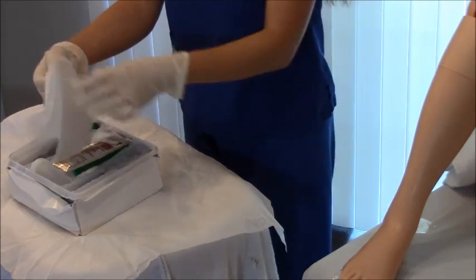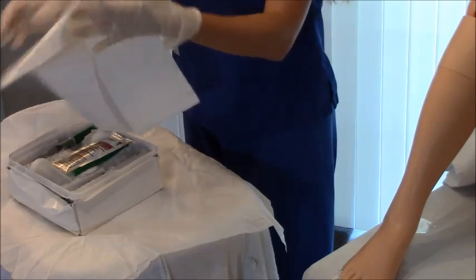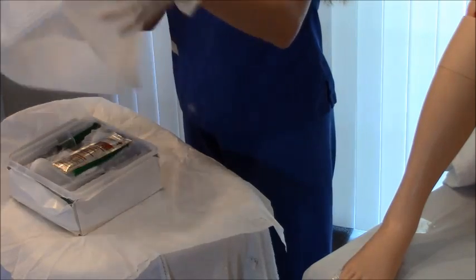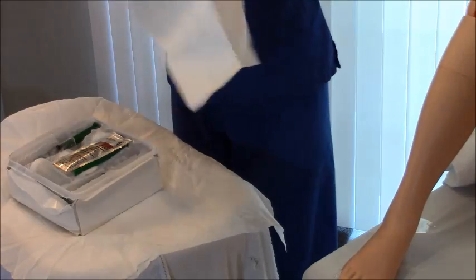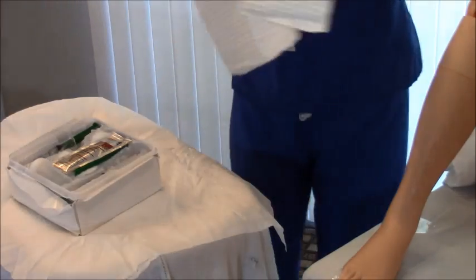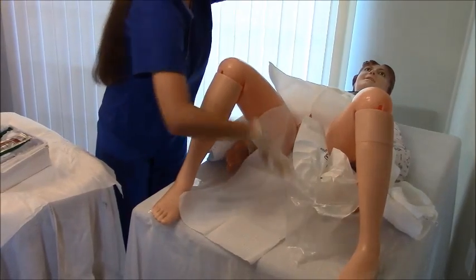There is also a second drape in the kit. I use it sometimes and sometimes I don't — it really depends. If you use it, lay it down carefully so you don't contaminate your gloves.